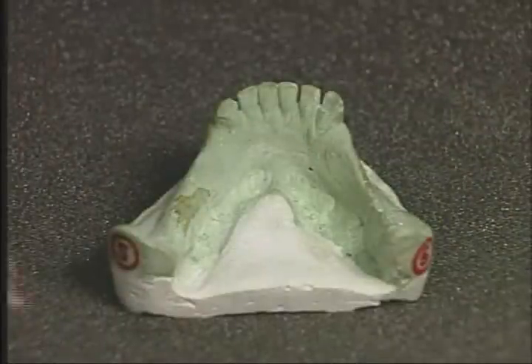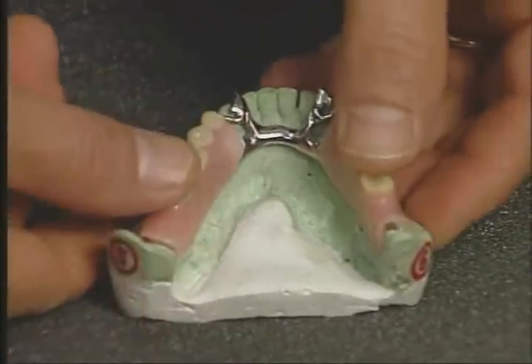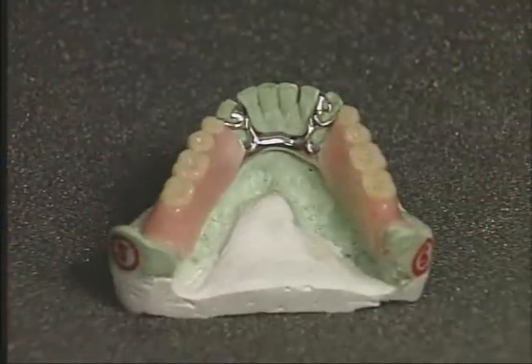Three, the partial must be extremely aesthetic. For most patients, unsightly clasps are an emotional problem, and many patients reject the placing of a restoration in their mouth because of the ugly metal. Four, the partial must be retentive and stable so as to give the patient utmost comfort during mastication and at rest.